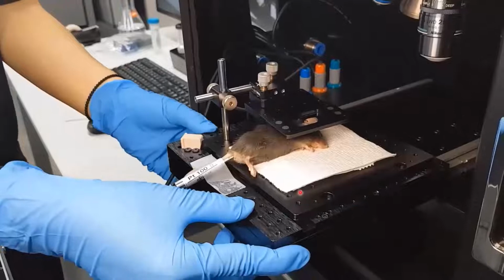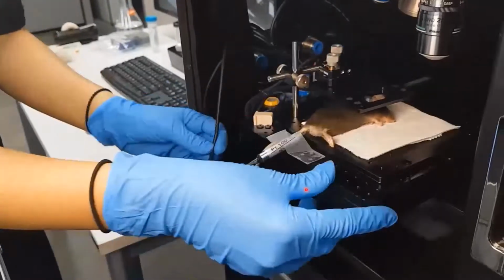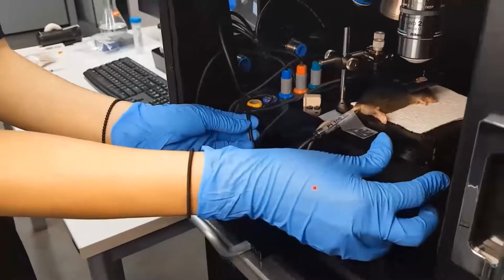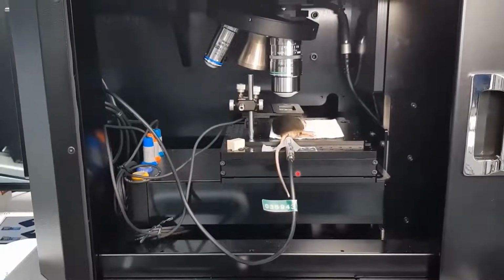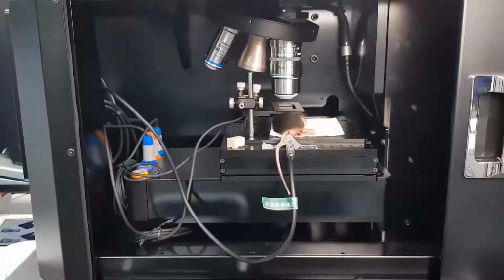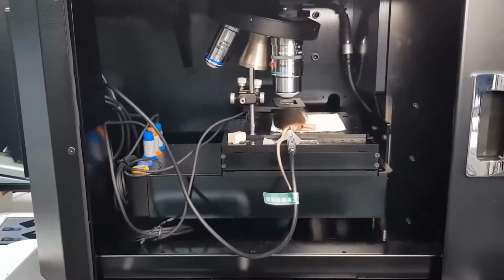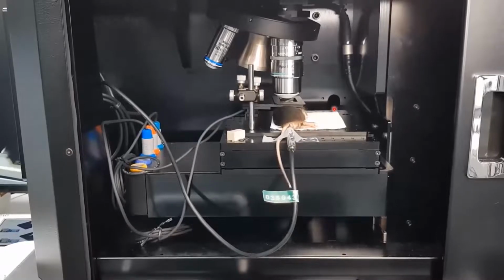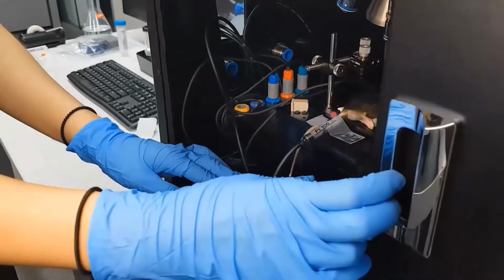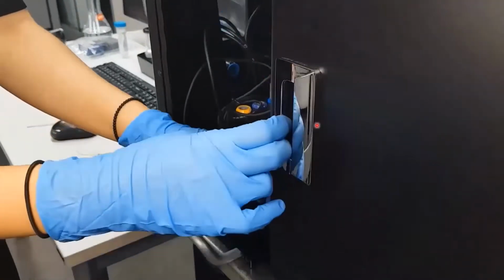Then place the imaging area in the middle of the objective lens using the stage controller, and adjust the focal distance by minimizing the distance between the specimen and the objective lens using a stage jog. And then close the door to prevent light from outside.